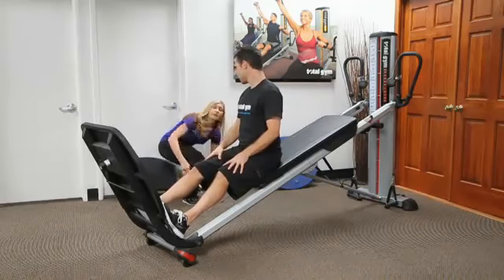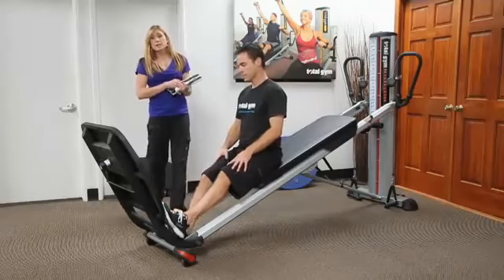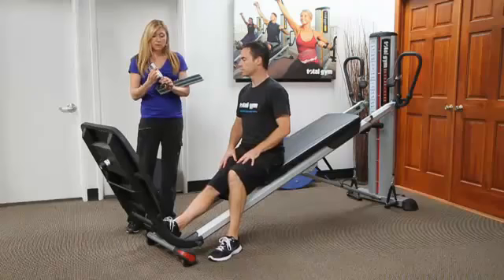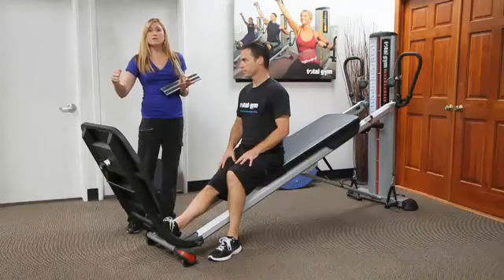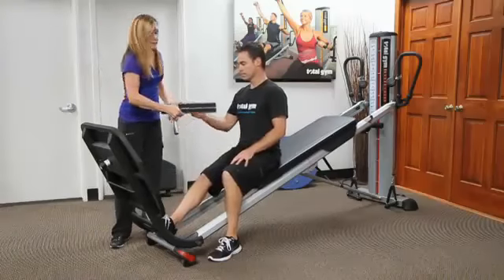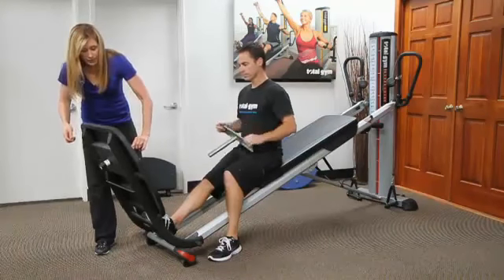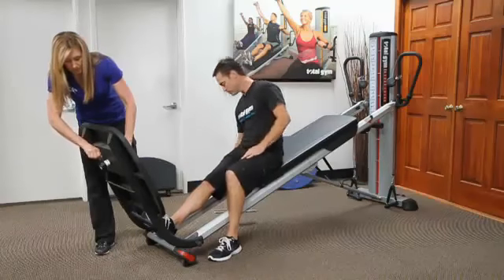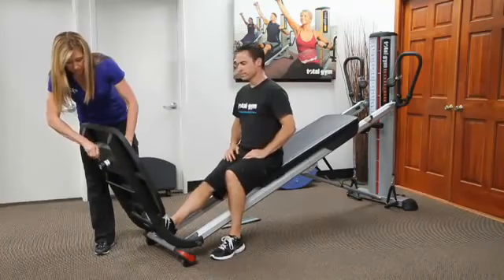The last thing I want to talk about with respect to this platform is that we have an adaptability of the BAPS board, which is really nice, so you can actually add some partial weight bearing. Right here you just have a little bit of holes that will tell you how far out, like that of the ball width. So I'm going to have you hold this for me. You're just going to place it through. You line up the holes, place the pin in, like so.